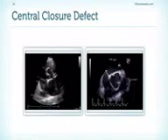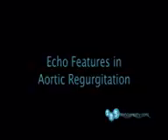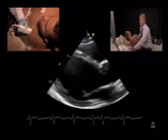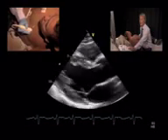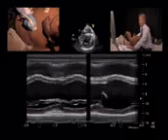But now let's go back to our patient we saw previously with a bicuspid valve and take a look at what other findings we can find. Let's take a look at our patient. So in the parasternal long axis view, it is clear that the size of the left ventricle is not normal, but that it is actually enlarged. We can appreciate that also in the short axis. This is the short axis view. And it's also apparent that the patient has hyperdynamic left ventricular function. See how large the left ventricle is.